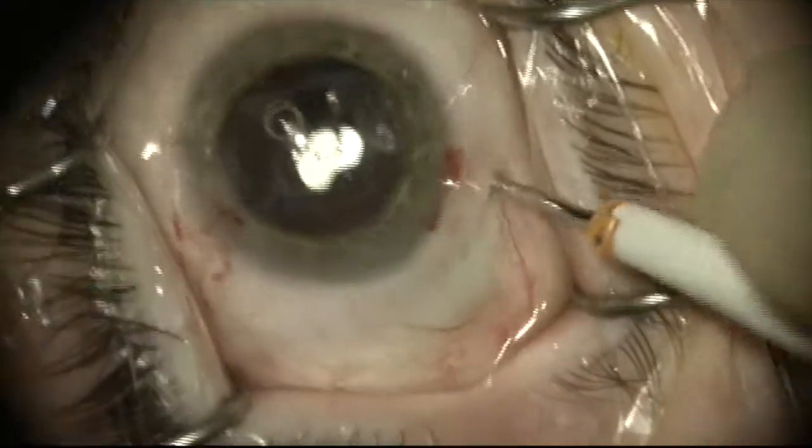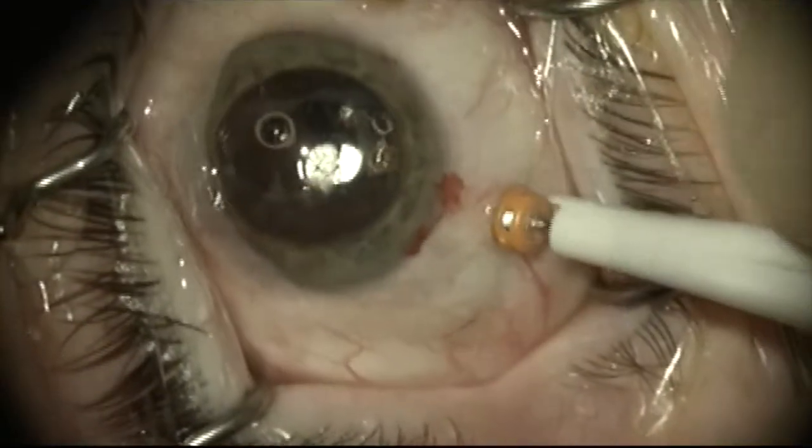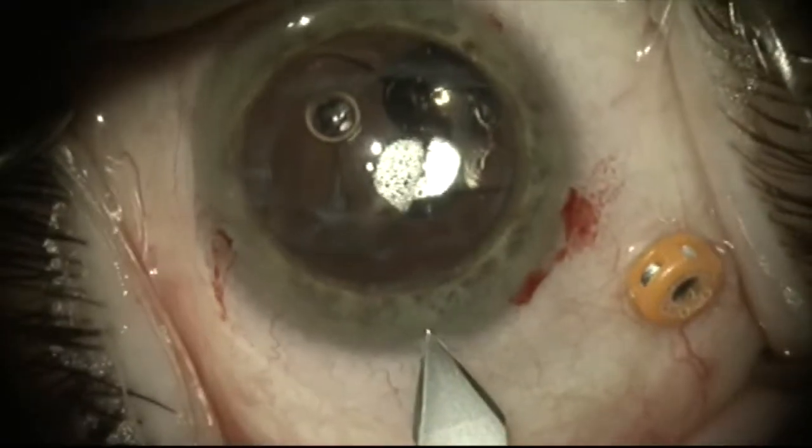Because the posterior capsule is mostly absent due to the extensive YAG laser treatment, a pars plana vitrectomy will need to be done prior to attempting to remove the lens.